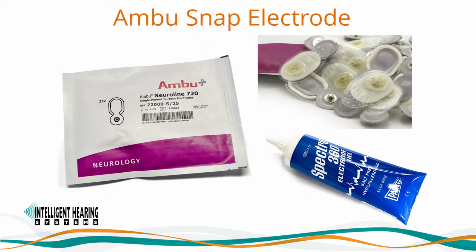When placing the snap electrodes on the patient, make sure to press around the white edge of the electrode to adhere the electrode to the skin. Do not press on the center of the electrode sensor, where the sensor sponge is located, since this area is conductive and the conductive gel may spread and compromise the adhesiveness of the electrode. If impedances are high, remove and discard the snap electrode.